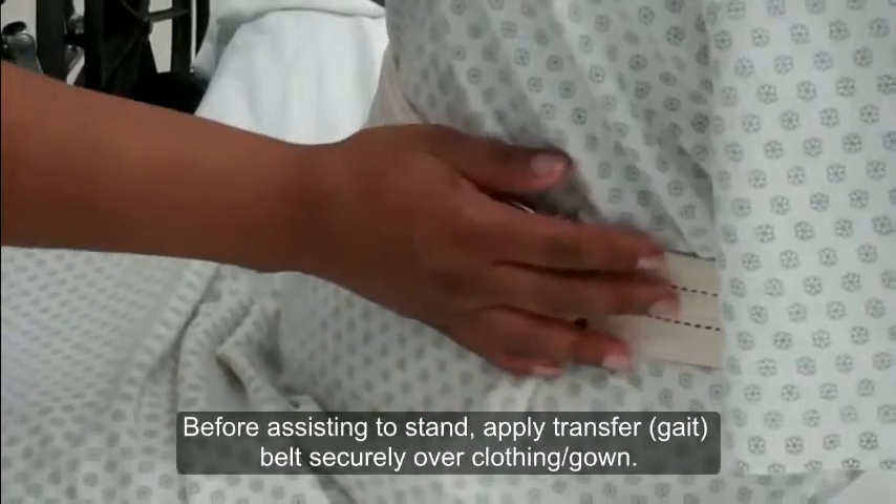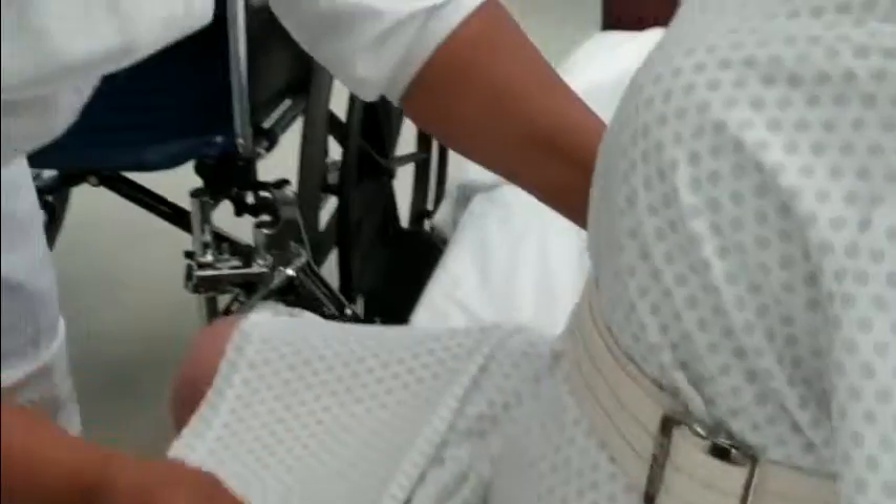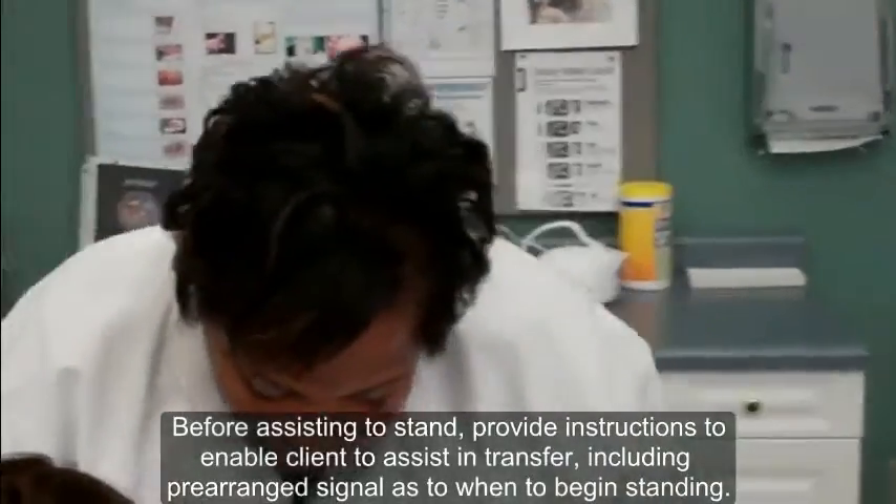I've ensured that the gait belt is to the side of the patient's navel area. Are you ready to stand? I think I am. Very good. I'm going to help stabilize your legs.